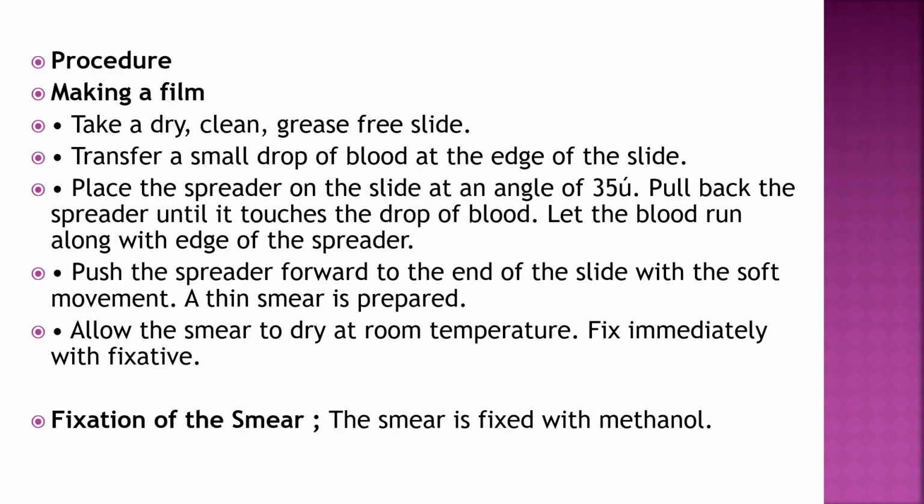In the procedure in short, you have to take a dry clean glass slide, then take 1 drop of blood at the end of the slide, and with the help of another spreader slide you have to spread that drop forward in the shape of a tongue, and then fix and stain it.